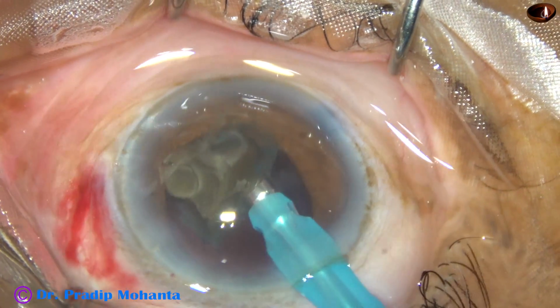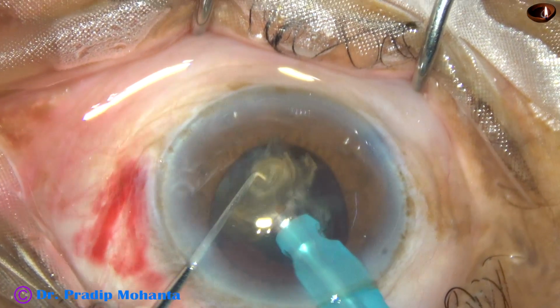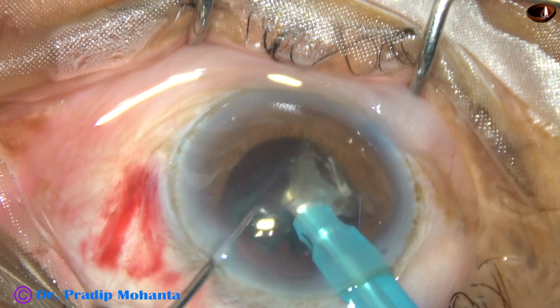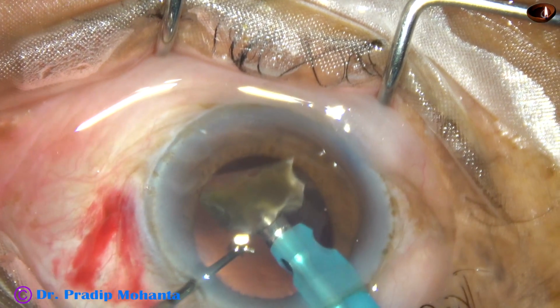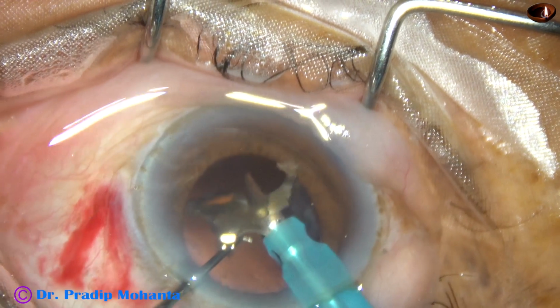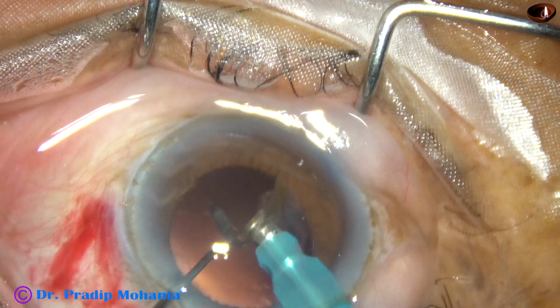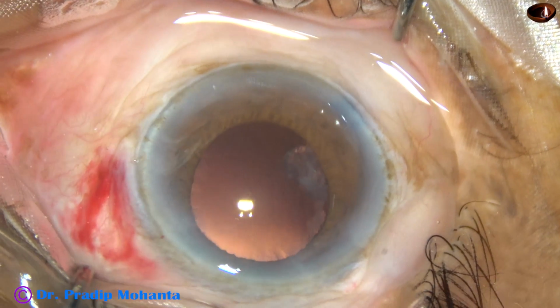And now this is the last nuclear fragment. At this time I ask my assistant to decrease the vacuum also. Vacuum was 400, flow rate was 40, and now vacuum is 100 and flow rate is 25. And very slowly I emulsify the last nuclear fragment. Take care of the posterior capsule. It should not come forward and I should not catch the posterior capsule. If I have any doubt of anterior chamber behaving abnormally, if I have any doubt that the posterior capsule may come forward, I will apply the intraocular lens first and then emulsify the last piece using the intraocular lens as a scaffold.